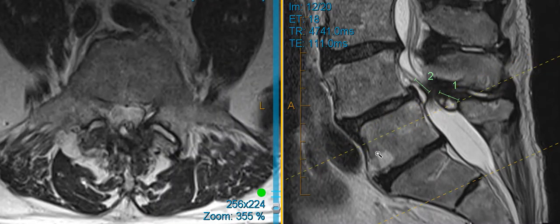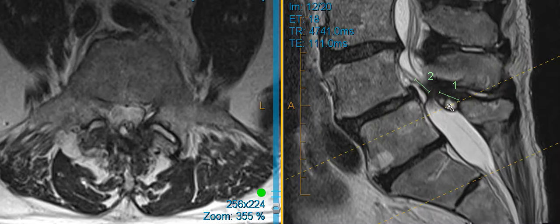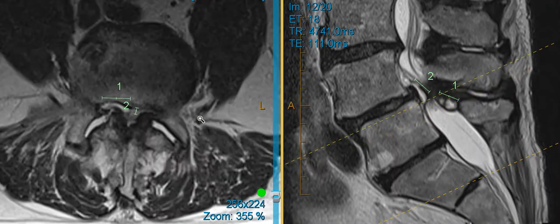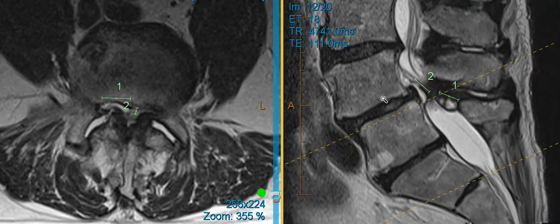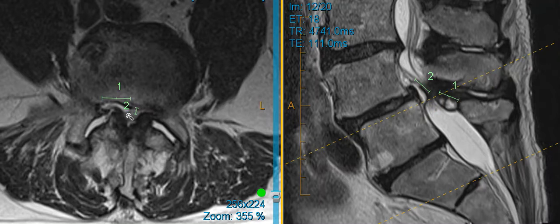Here's that midline synovial cyst that correlates to this region right here. All of those things together as well as degeneration collapse of this disc and the slip are contributing to some pretty significant stenosis.